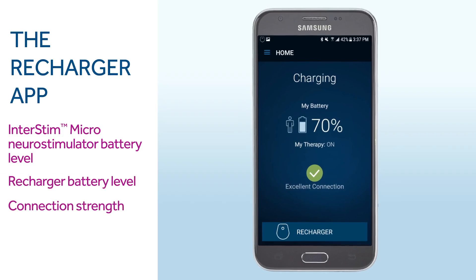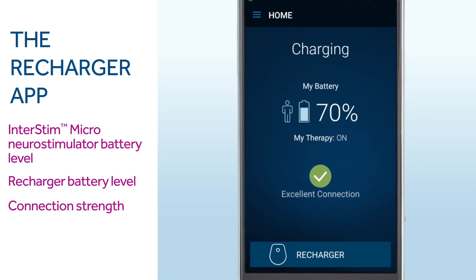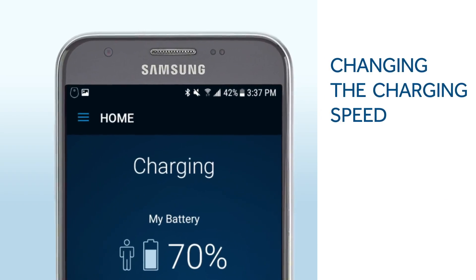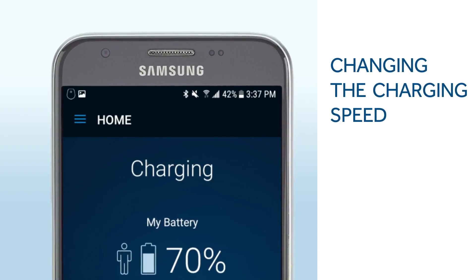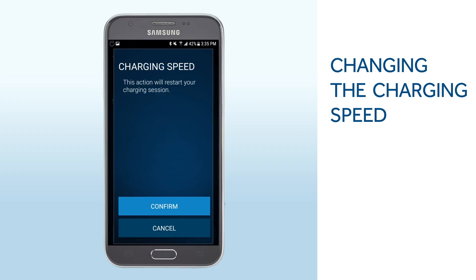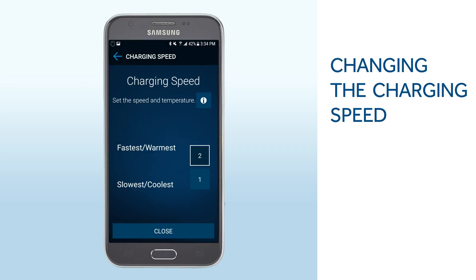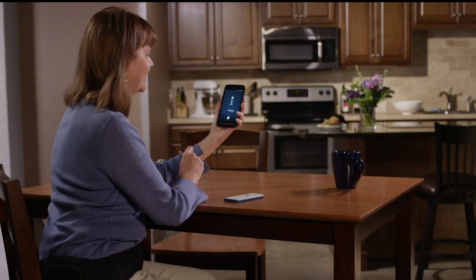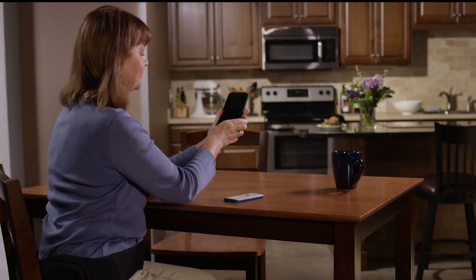Either good or excellent connection is sufficient for a successful recharge session. Your charging speed is preset to fastest mode. If the sensation is uncomfortable, you can change the speed. Select the menu icon on the top left of your programmer screen, then select Charging Speed, and tap Confirm. There are two charging speeds: Fastest and Slowest. If you choose Slowest, it will increase the time of your recharging session. Once you've finished your adjustments, you may put your programmer to sleep by giving the power button on the side of your smart programmer a short press.